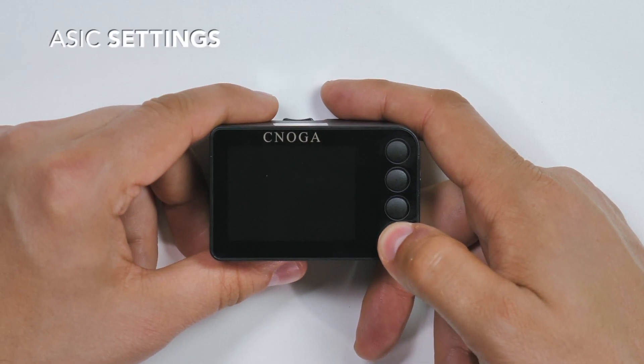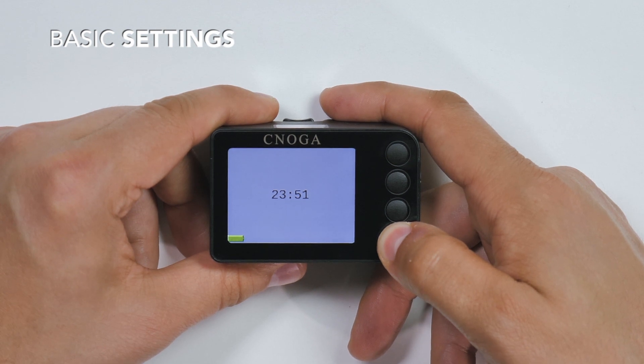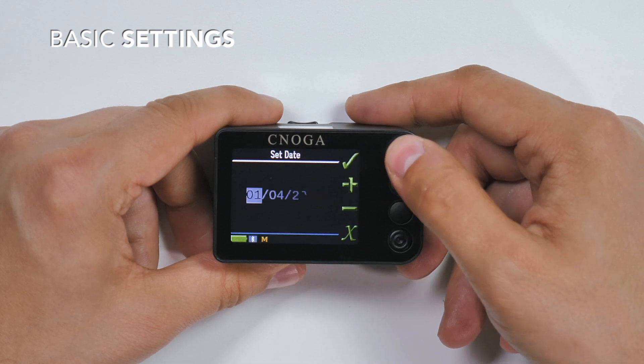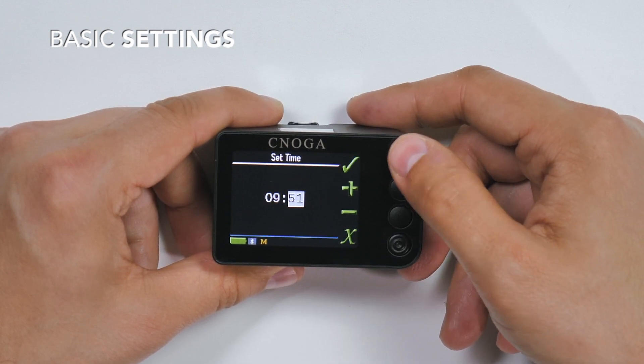Turn on the device manually by holding the ON/OFF button for 3 seconds. Set the basic settings following the instructions shown on the screen. Set the language, date, and time, and press OK to finish the setup.